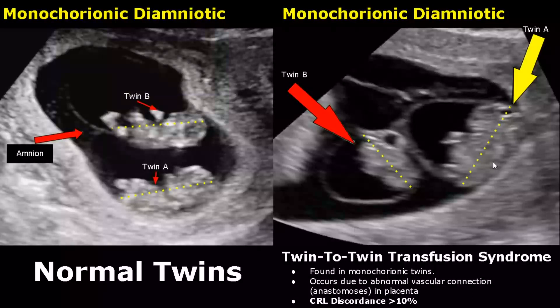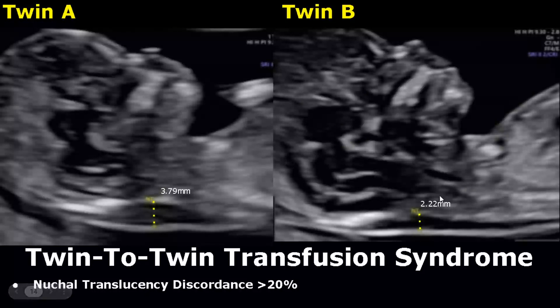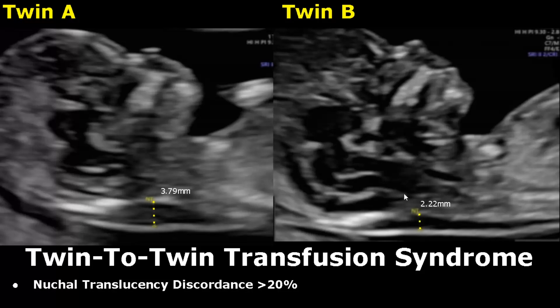Twin-to-twin transfusion syndrome is a complication found in monochorionic twins. It occurs due to abnormal vascular connection in the placenta. In the first trimester, we may start to see discordance between the CRL of the twins — a 10% difference in CRL measurement can be a sign of an impending twin-to-twin transfusion syndrome, with twin B smaller than twin A. A nuchal translucency discordance of greater than 20% is another sign, and here you can see a significant difference between NT values.